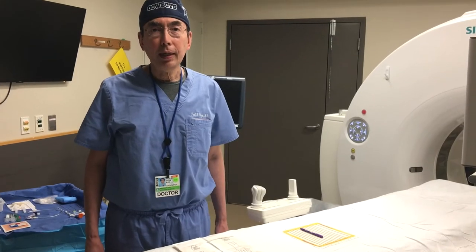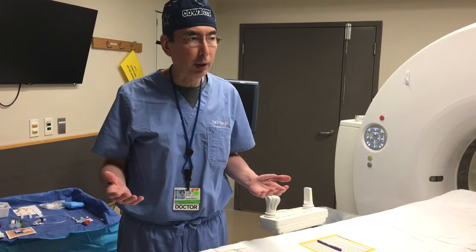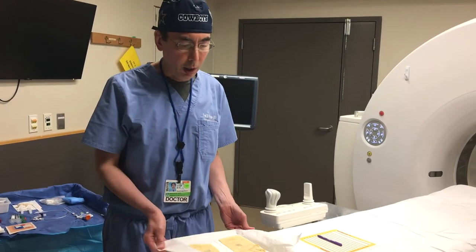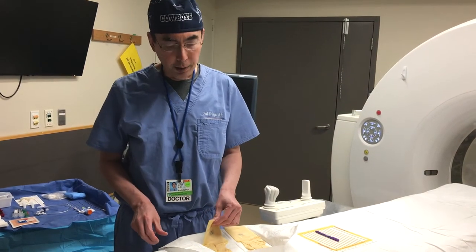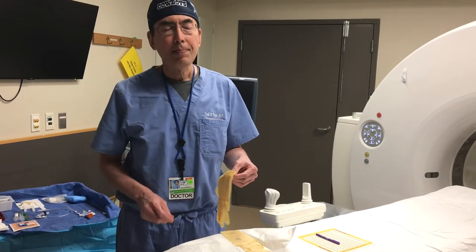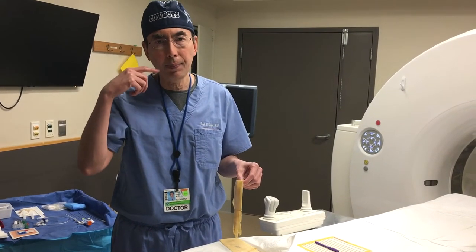I'm Dr. Shen and we're going to talk about a variety of topics to get you started in CSIR, cross-sectional interventional radiology, where we do image-guided biopsies, drainages, and other procedures. One of the first things after you've consented the patient and done your timeout is you're going to gown up. For a paracentesis, thoracentesis, or lumbar puncture where you're putting a single needle in and removing fluid, you'll just put gloves on. For everything else, you'll also gown and glove, and of course you always wear a cap and a mask.